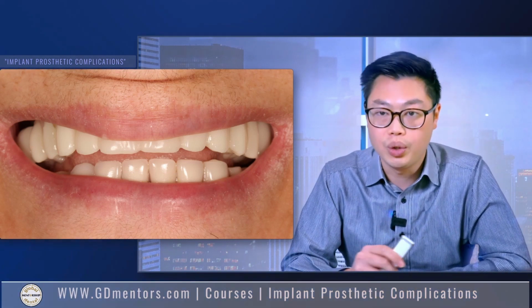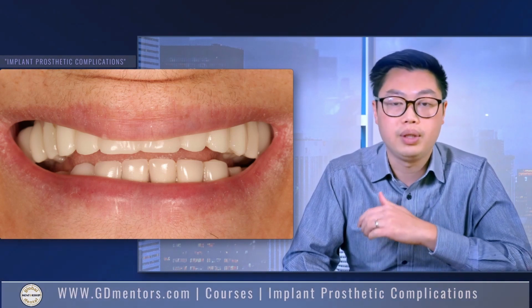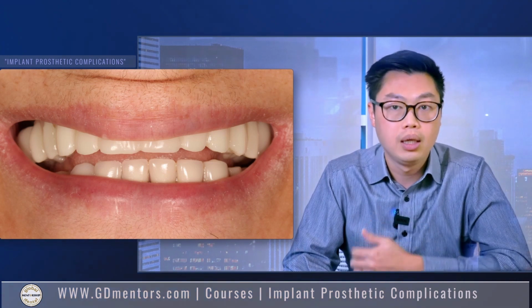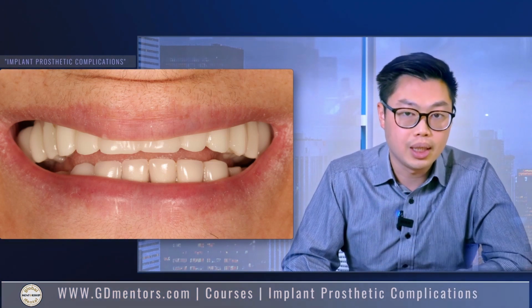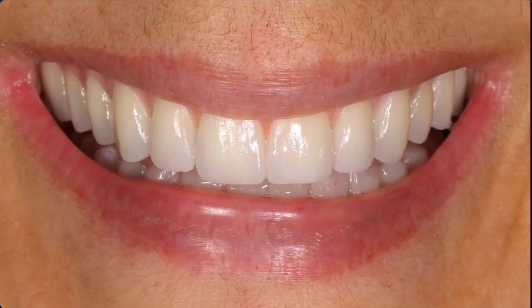The upper teeth are way too wide. There's no buccal corridor. There's a reverse curve. The upper anterior teeth are way too short. This patient's showing way too much lower teeth. The vertical dimension probably needs to be changed. We need more information to assess whether the vertical dimension needs to increase or decrease. So this is the after.